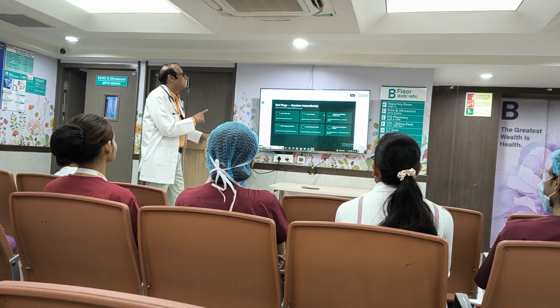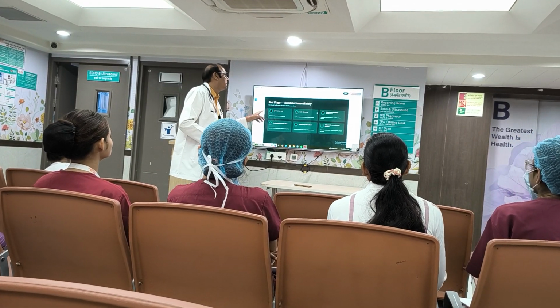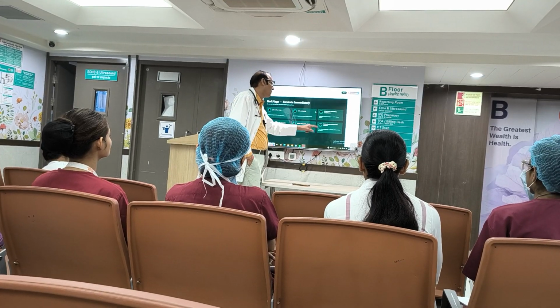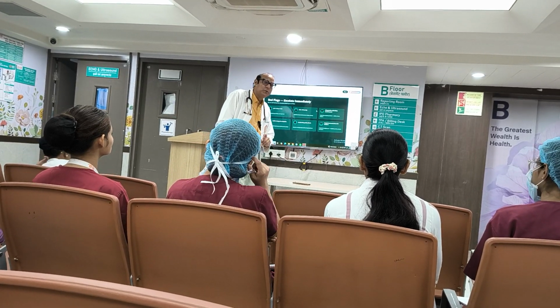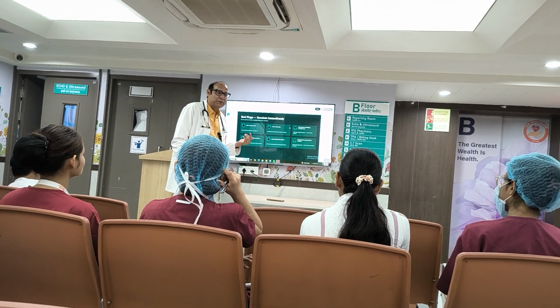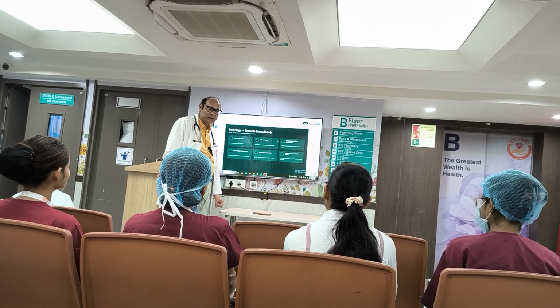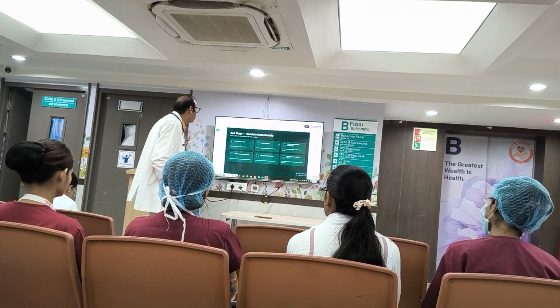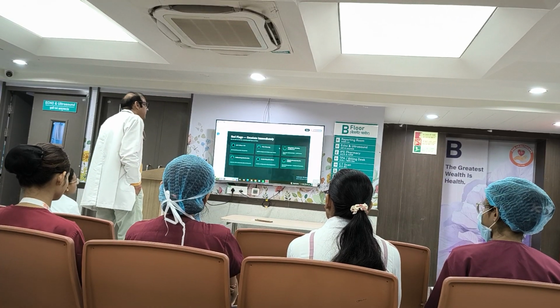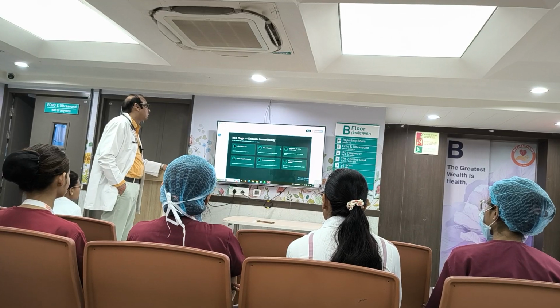Fourth, rising PCO2 also has to be considered. How much rising PCO2 means impending respiratory failure, okay. If PCO2 is going to be high, like 60, 65, 80, it means impending respiratory failure, the patient is going to have a respiratory arrest. Next is sudden change in baseline, an acute shift in a previously stable chronic patient.